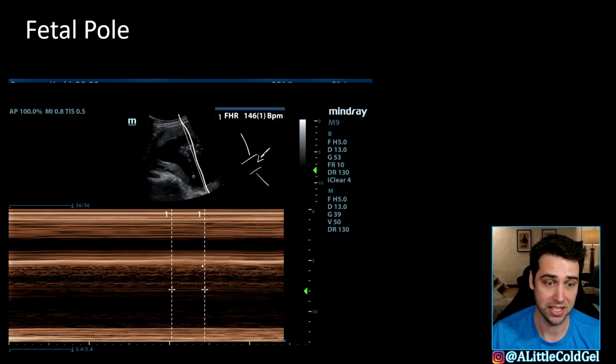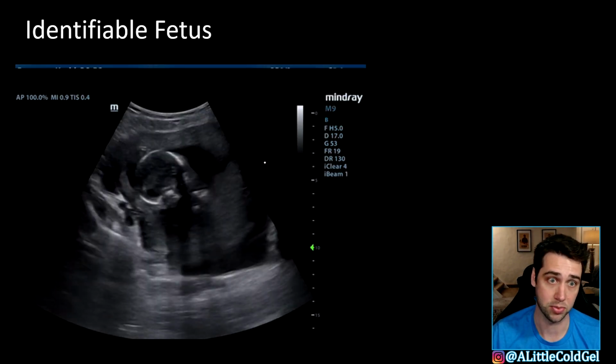You can see, obviously, it's a little harder to make out what's going on here. So you have to practice it. The pulse wave is definitely easier, but we don't recommend it. You will see that some sonographers use it. The literature doesn't really suggest that it is harmful, but there's a potential there, so we avoid it. Again, 6 weeks for that.